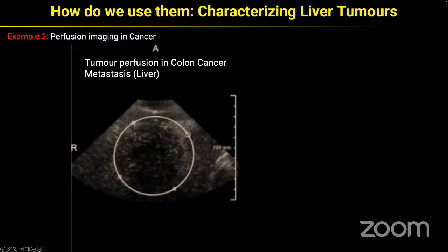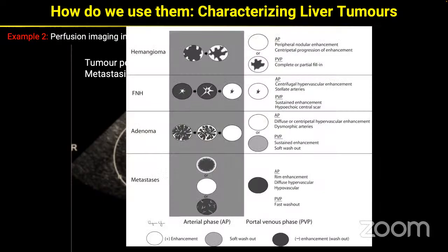These tumors have really interesting wash-in and wash-out characteristics. Stephanie went through and characterized a whole bunch of them in different tumors, and based on the wash-in, wash-out criteria, she's been able to identify many different tumor types just on those characteristics. It's really interesting, and definitely worth taking a look at some of her work.